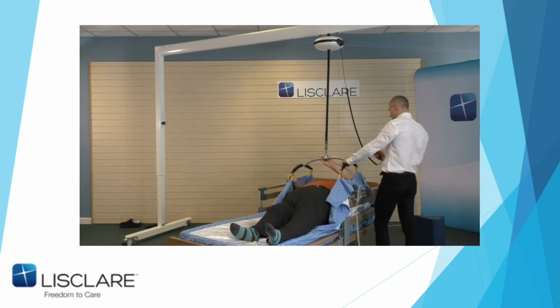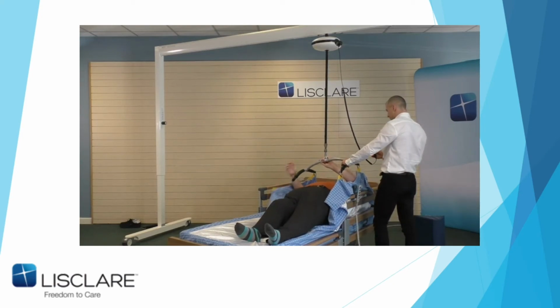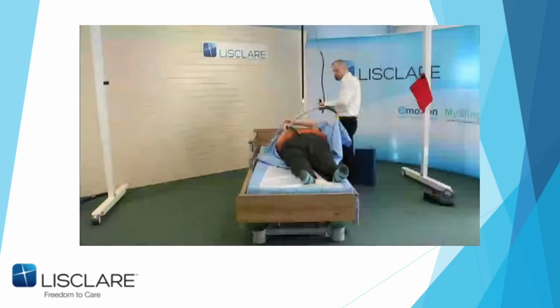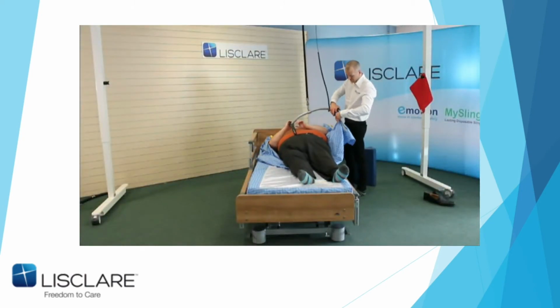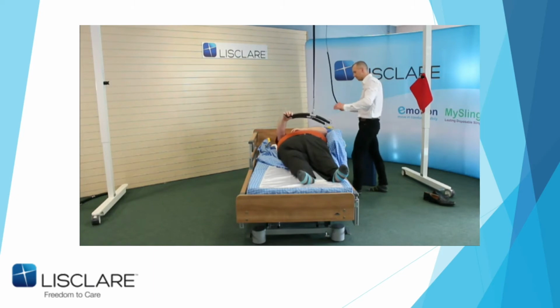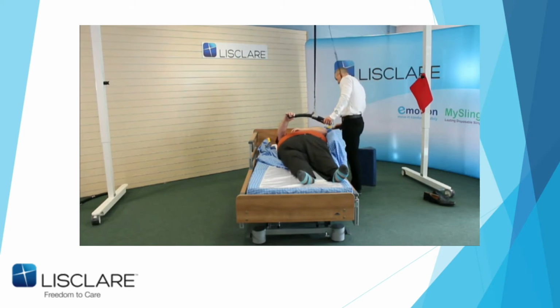And then, John, if I help him out, see him walking round. Now, with this spreader bar, John knows that he has to use that side, okay, because it's going to tilt. It's designed to tilt. You'll see that. So if he hooks the shoulders on, John, head, arms and shoulders.